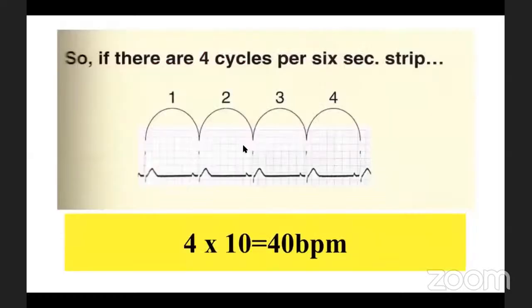أوكي الحين هذه ال ECG عندنا نشوف ال R wave الأولى ثانية ثالثة رابعة خامسة. طيب كم في سايكل كاملة؟ هذه 1 سايكل، هذه 2 cycles، هذه 3، هذه 4. فإيش أسوي الحين؟ أضرب ال 4 by 10 راح يطلع لي 40 beats per minute. هذه الطريقة سهلة مرة يعني نقدر نحسب فيها الريت في حالات الأريثميا. إذا مثلا كان عندنا هذه طويلة وهذه قصيرة فجأة، وهذه راح نجي للرhythm إن شاء الله.